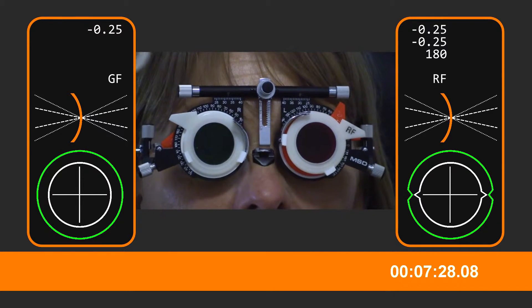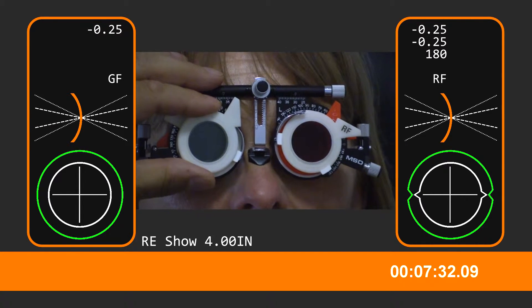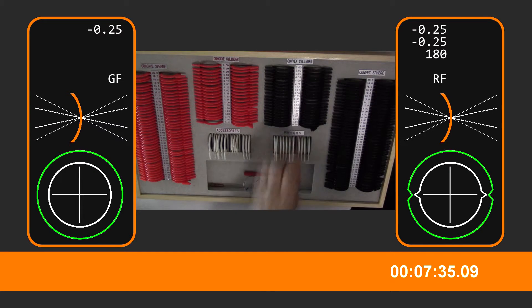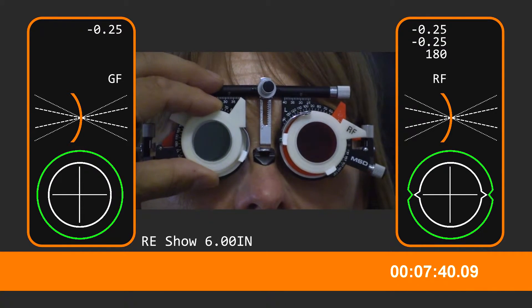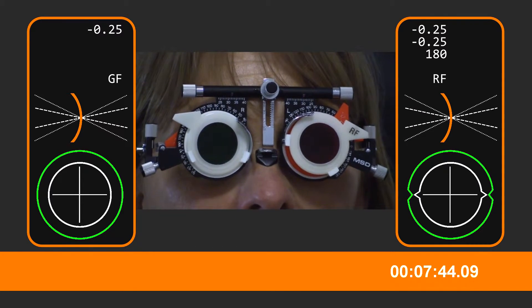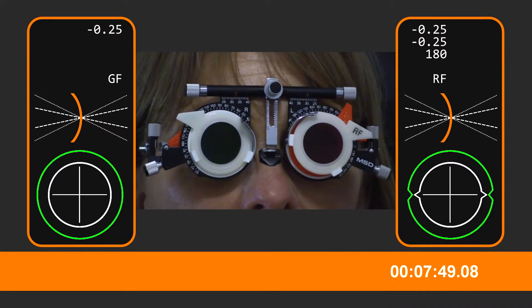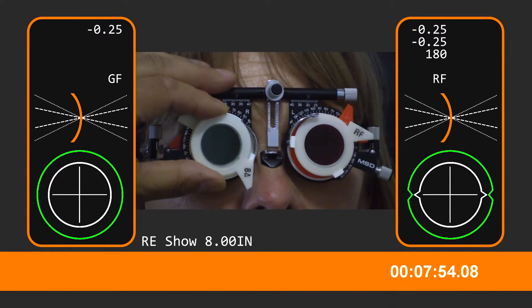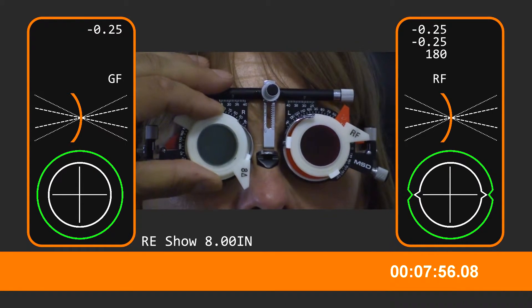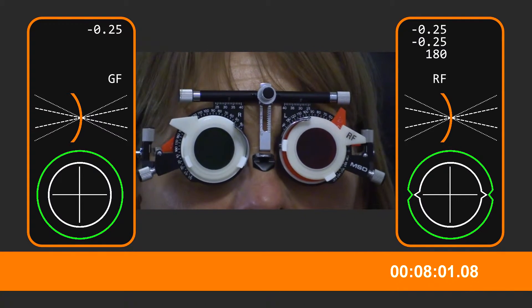So if I put that one in, what about now? Not quite in there yet. Coming in but not fully in? Not fully in, no. What about if I put this one in? Not quite, no. And what about this one? Yeah, that's better. I can hold it in the centre now. Sort of in the middle, is it? Yeah.